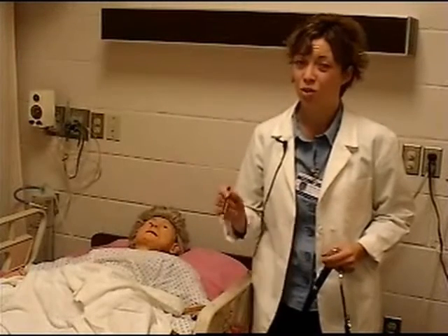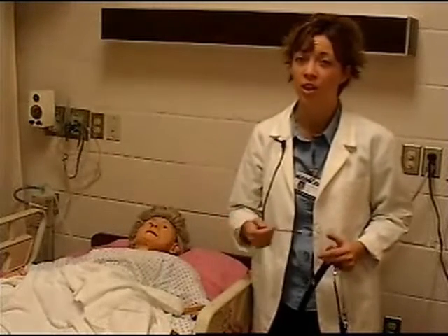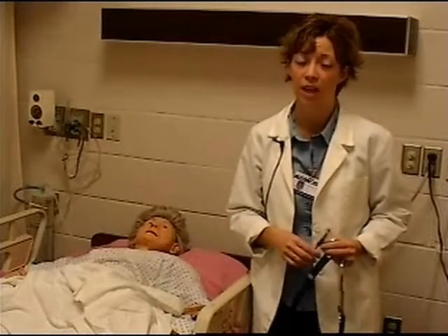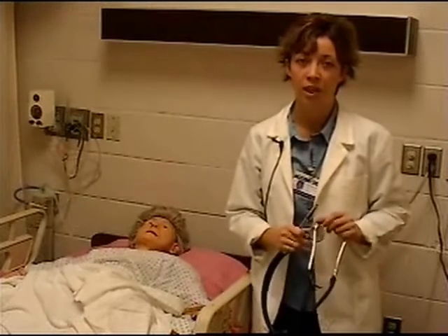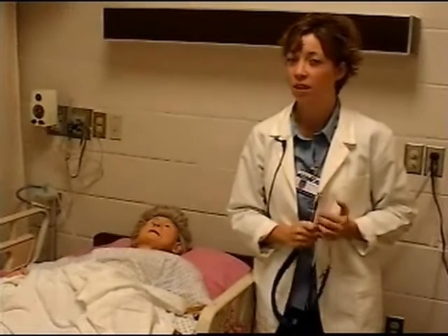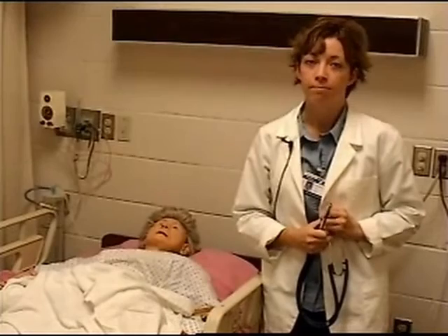Now, nurses do help when these are inserted with filling them appropriately with water and setting up the sterile field and helping the doctor. So again, just review any anatomy that you need to and definitions of the things that can cause the need for a chest tube.